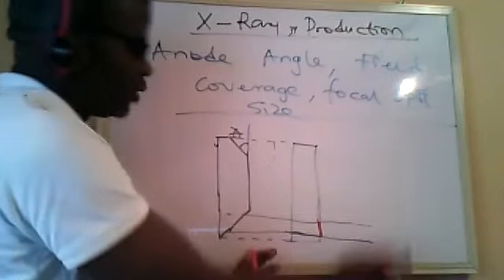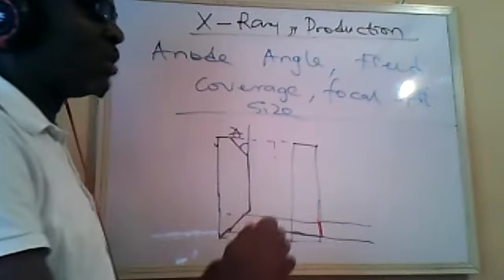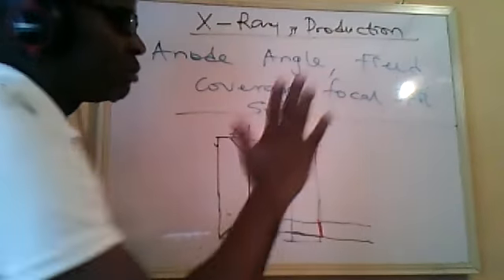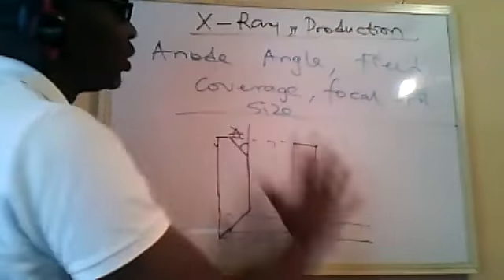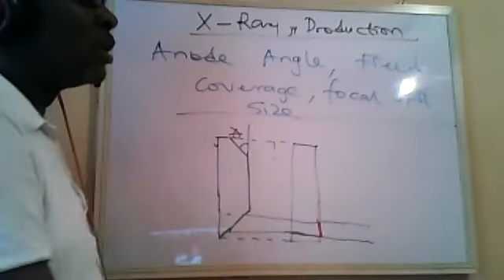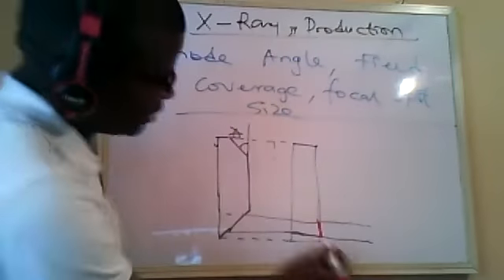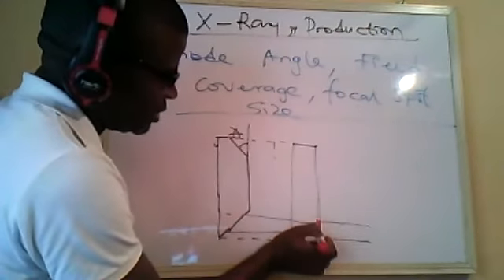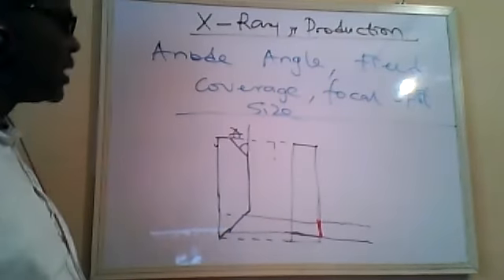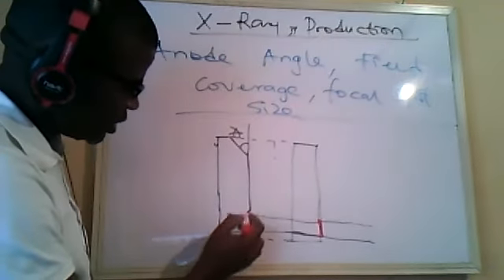Of course, we are just looking at this two-dimensional structure. It's actually two-dimensional. The X-ray comes as a kind of beam this way, impinging on them. Assuming this is the surface, it comes this way. So we are actually looking at just one dimension of such a beam, the length. So this is the area the X-ray is going to hit if it were to be this, but if we now angulate the anode, this is the effective area it is going to hit.